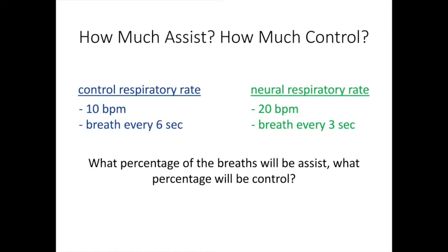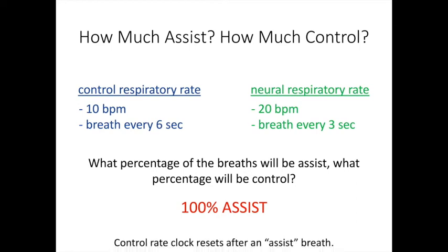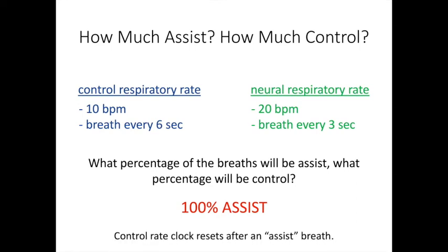Well, one would think it would be some combination of assist and control breaths because you have both available, but it turns out that 100% of the breaths will be assisted breaths. And that's because the control rate clock resets after every assist breath. There will never be a 6-second time period without any breath.